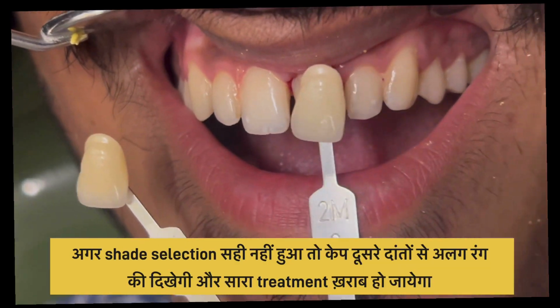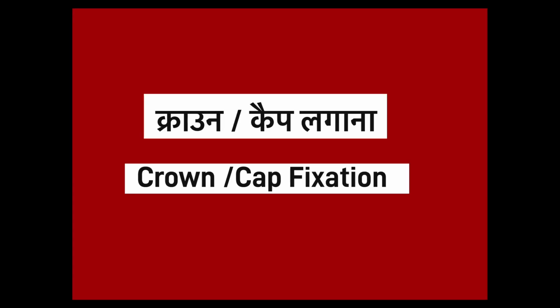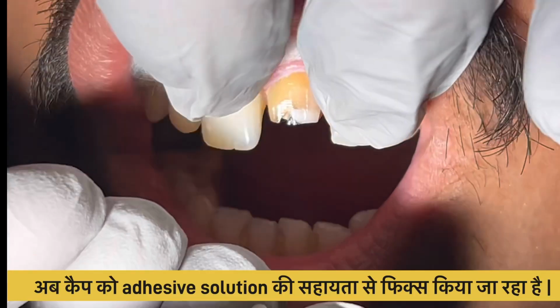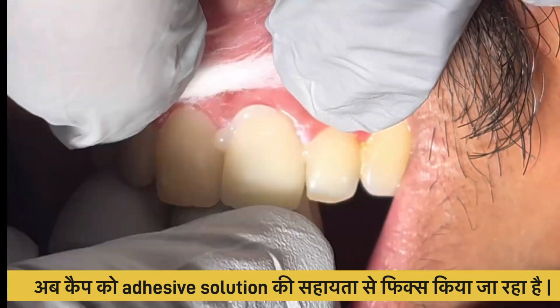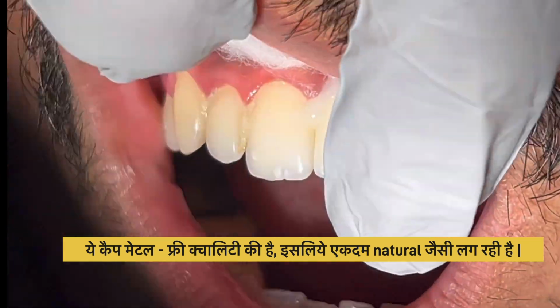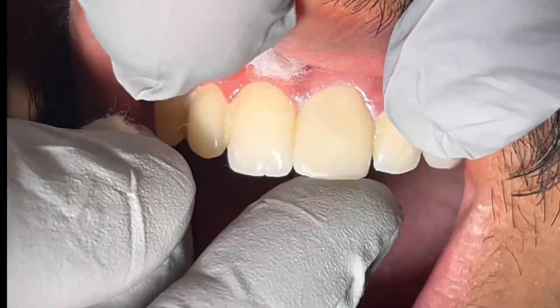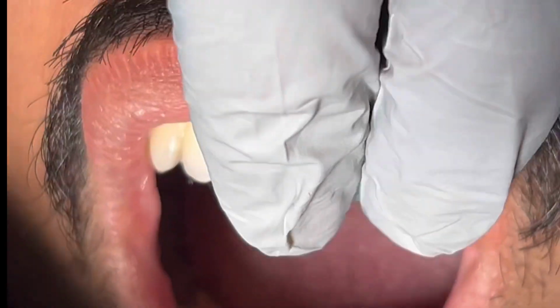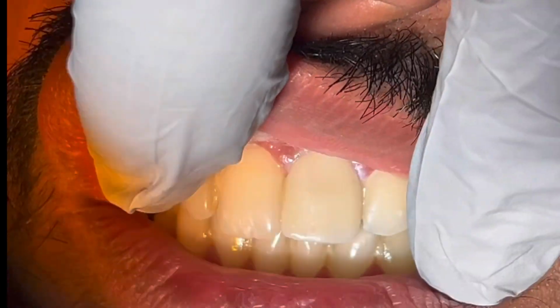Proper shade selection is crucial for front teeth caps. If it's not done correctly, the entire treatment may be compromised, as the color of the cap greatly affects its aesthetic appeal. Now the cap will be fixed using adhesive material, and here we are using the metal-free cap. For front teeth, metal-free caps are the preferred choice due to their natural appearance and compatibility. There are different types of caps available in the market, but metal-free caps are the best for the front teeth.